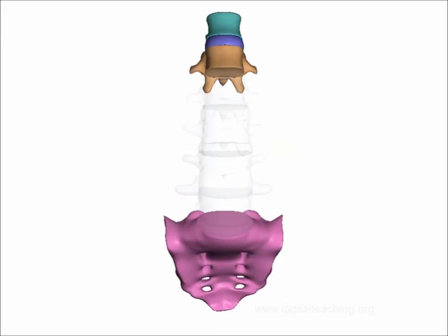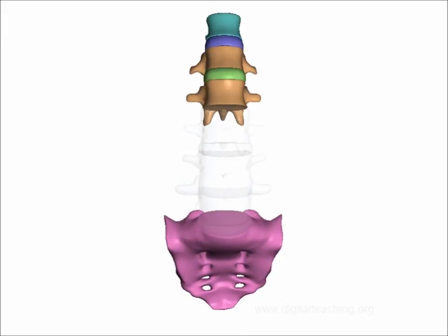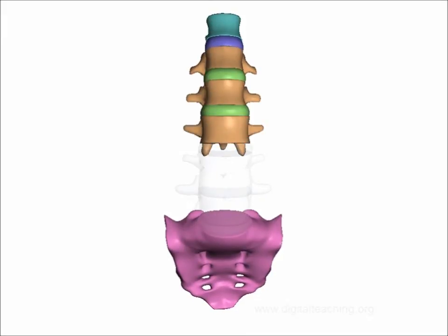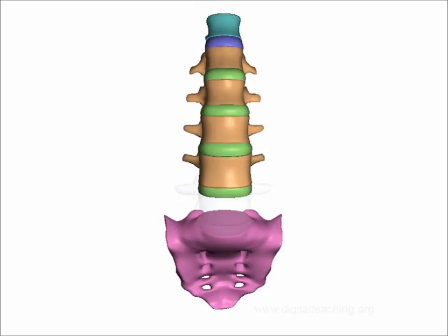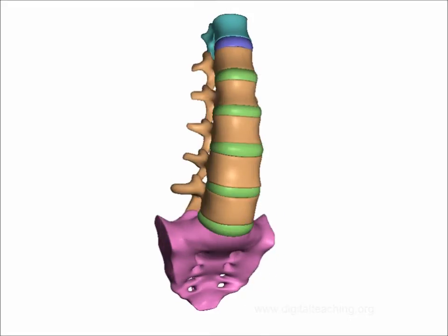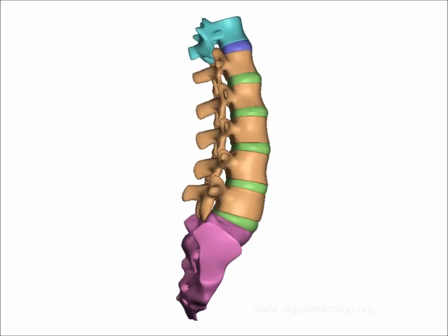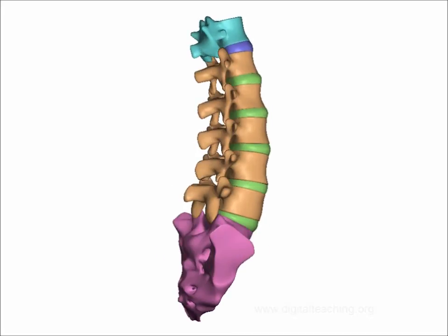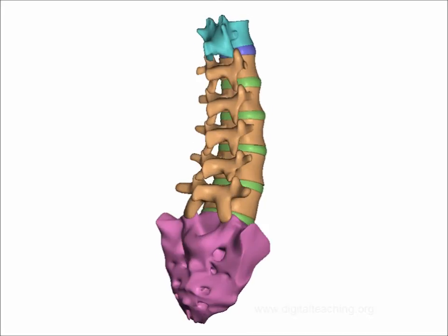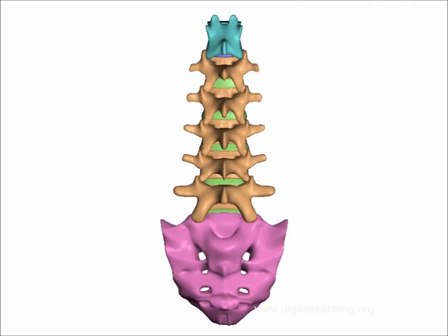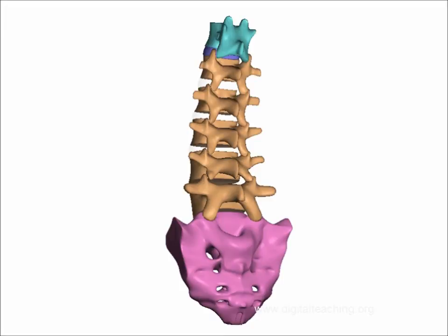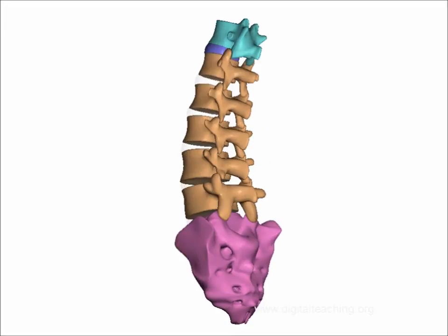Now it will be easy to identify the Scotty dog in 2D animation. Now try to identify the Scotty dog when I move the images. Now do you see the Scotty dog here? Here.